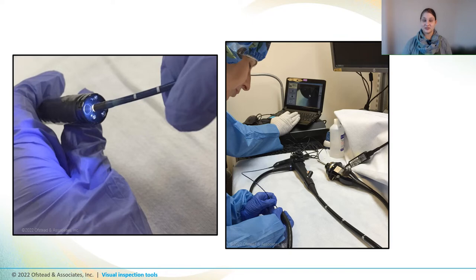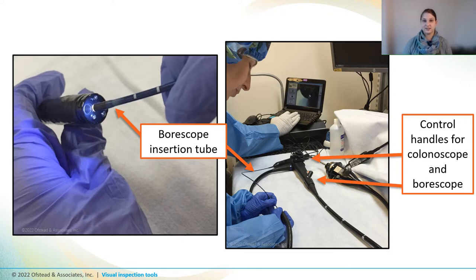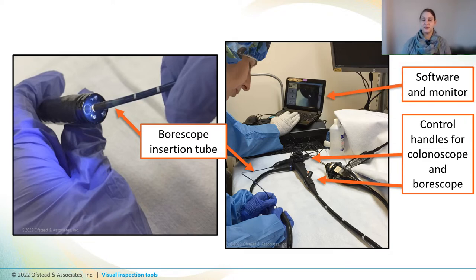Boroscopes are basically endoscopes that are small enough to fit inside other endoscopes so that you can inspect their ports and channels. They have an insertion tube or shaft that's similar to the insertion tube of other scopes and a control handle that lets you control brightness. And they can be hooked up to a monitor and software for taking photos and videos.